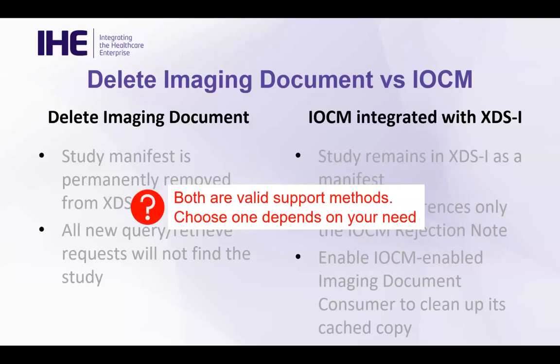They have a different approach, but they are both valid and supported methods. It depends on which mechanism your existing system already supports. Some may already be supporting IOCM, some may not. So you can choose one or the other, depending on your need.